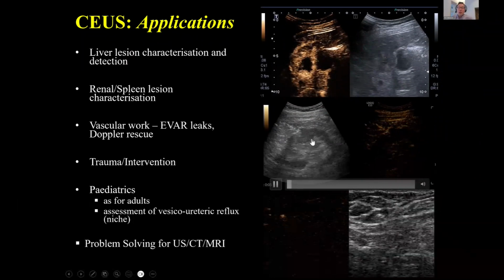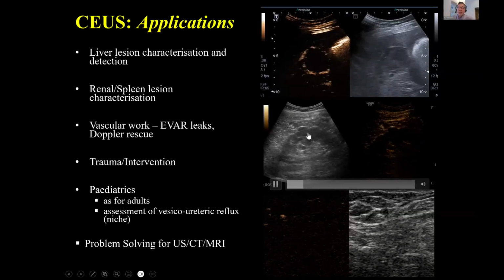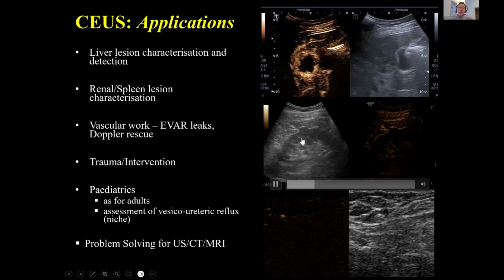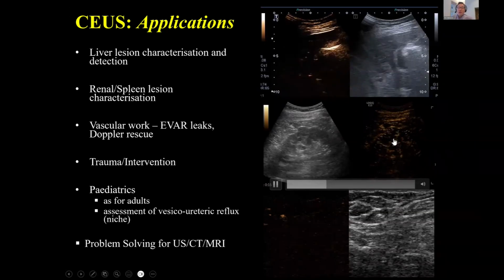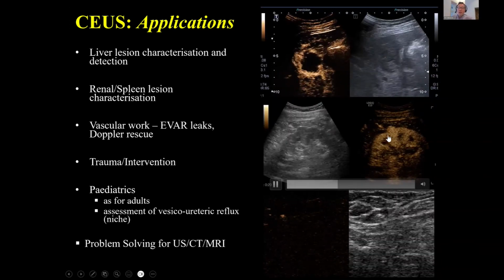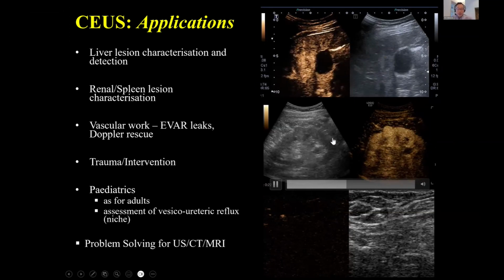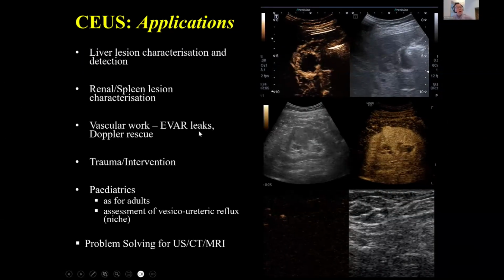Conversely, in this patient with this indeterminate nodule within the interpolar region of the kidney, the key thing here is whether it takes up contrast or not, and it's an enhancing lesion. Here comes the contrast, and you can actually see contrast enhancing this lesion itself. So it's a very avidly enhancing lesion in the arterial phase and has to be assumed malignant until proven otherwise.